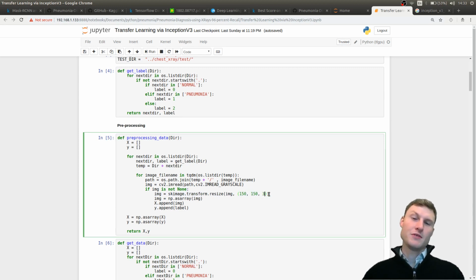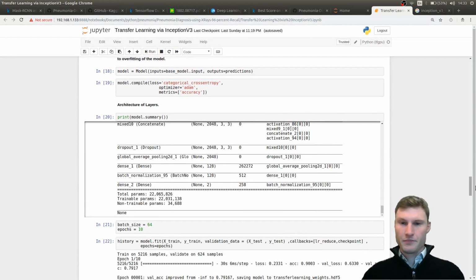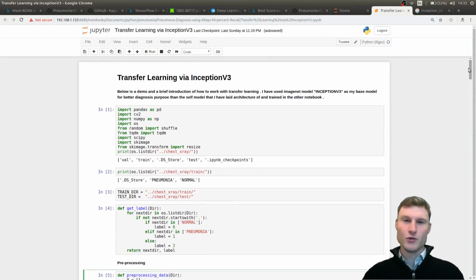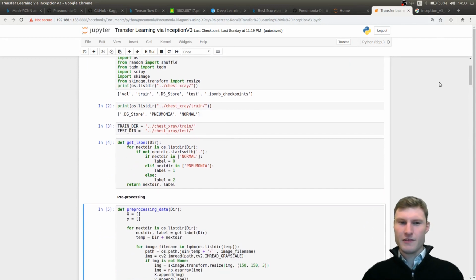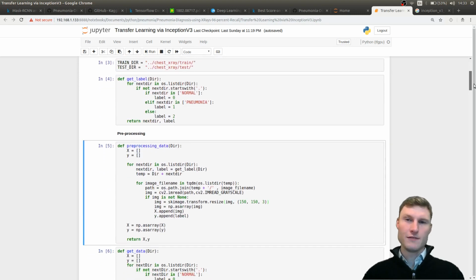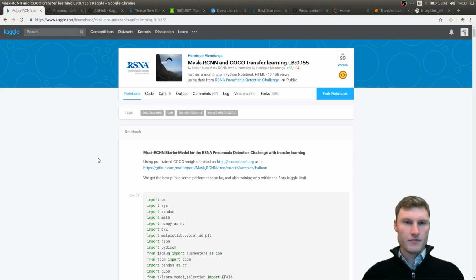And I believe if you use higher resolution, this would also mean that you have to change some parts of the model, basically using larger kernels at one point for taking account of higher resolution. You should have more precision or more accuracy. Yeah, that's from me. It's a very brief introduction of what you can do.